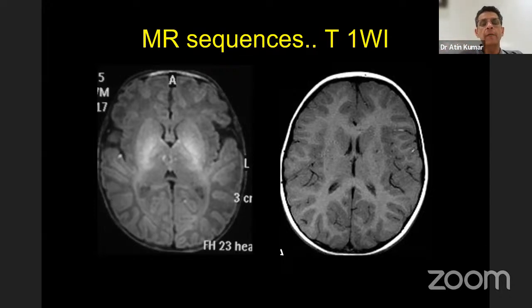In MR, we can play around with the protons, the signal coming from them, based on the types of pulse and the frequency of pulse which we give, to generate different signals from the same tissues. Dr. Manisha did tell about how we can play with the contrast levels on the CT scan console, to move the window to a bone window or a soft tissue window, but that's it. That's one image which is present.